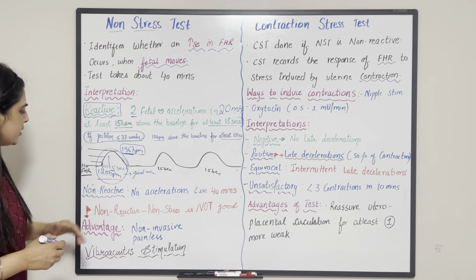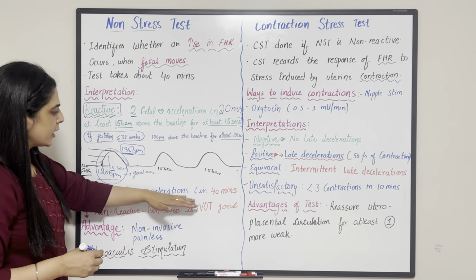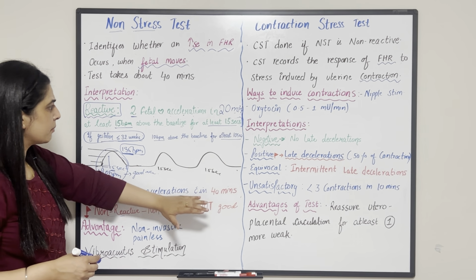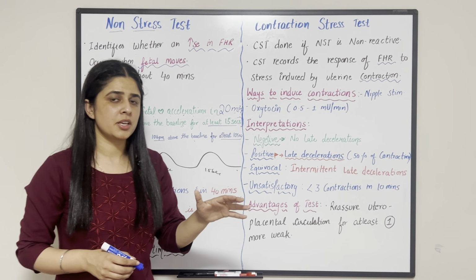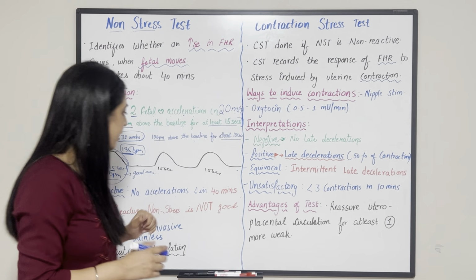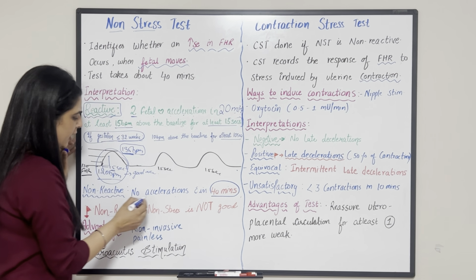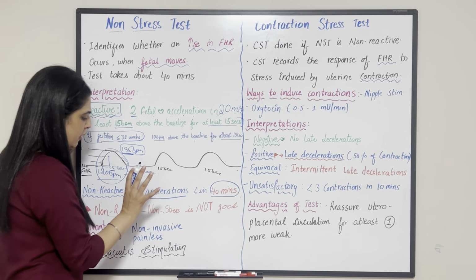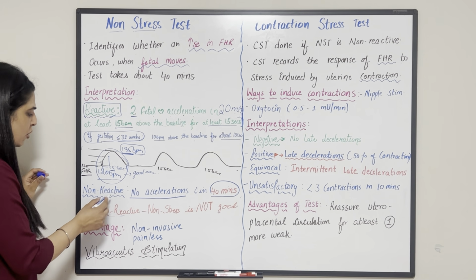Okay, so we say the test is non-reactive when we observe no accelerations in a 40-minute period. For example, we observe the fetus for the first 20 minutes and there are no accelerations, then we further observe for the next 20 minutes, and if in the 40-minute period there are no accelerations, that means the test is non-reactive.